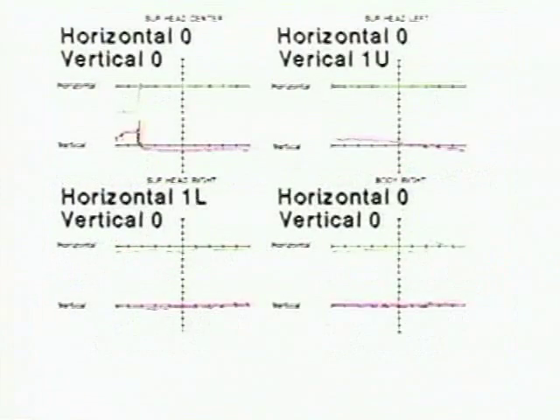The next 4 examples demonstrate negative positional testing in supine head center, left, right, and body right. This would be a negative result and would not be considered abnormal, but simply no score is present.